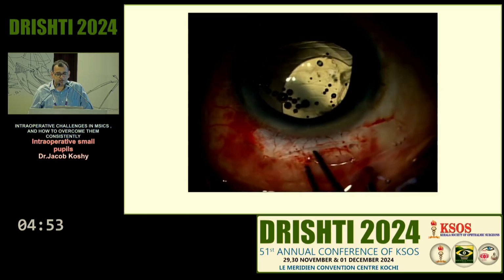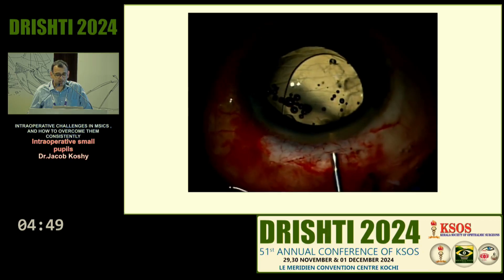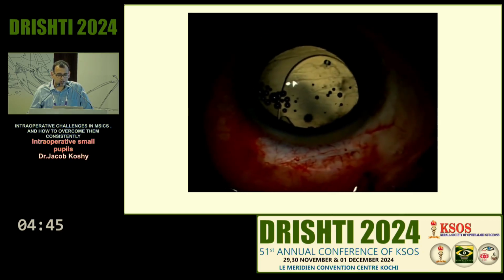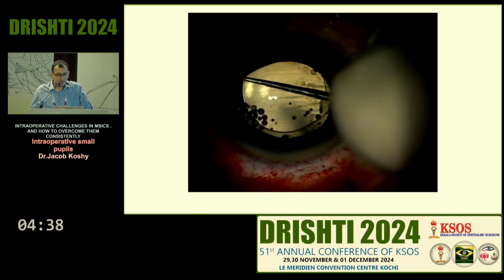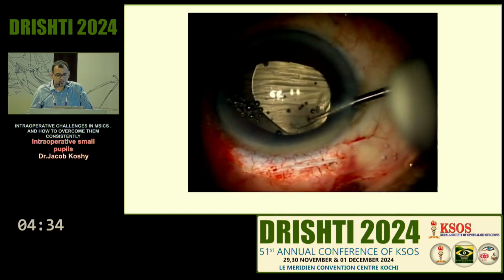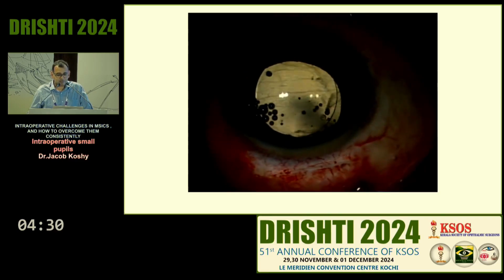And again, be careful to go just under the iris, above the anterior capsule, injecting viscoelastic, and then you can dial it or push it in on whatever technique you're more comfortable with. Yeah, and you find that the lens is pretty stable there because there was good anterior capsular support.